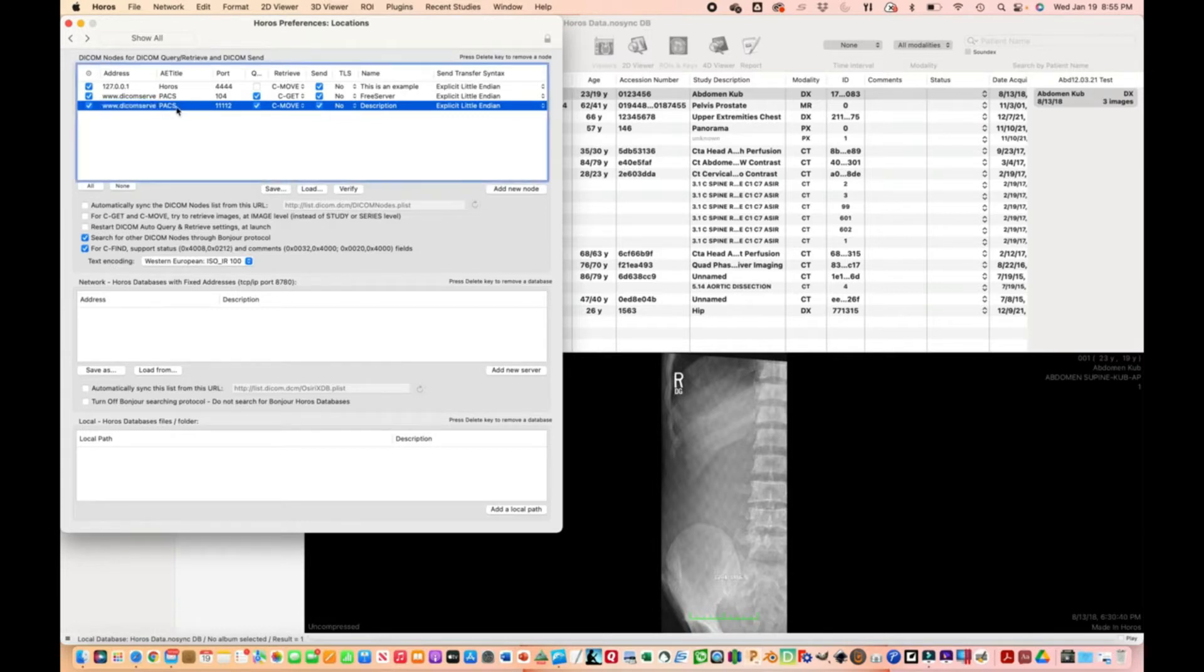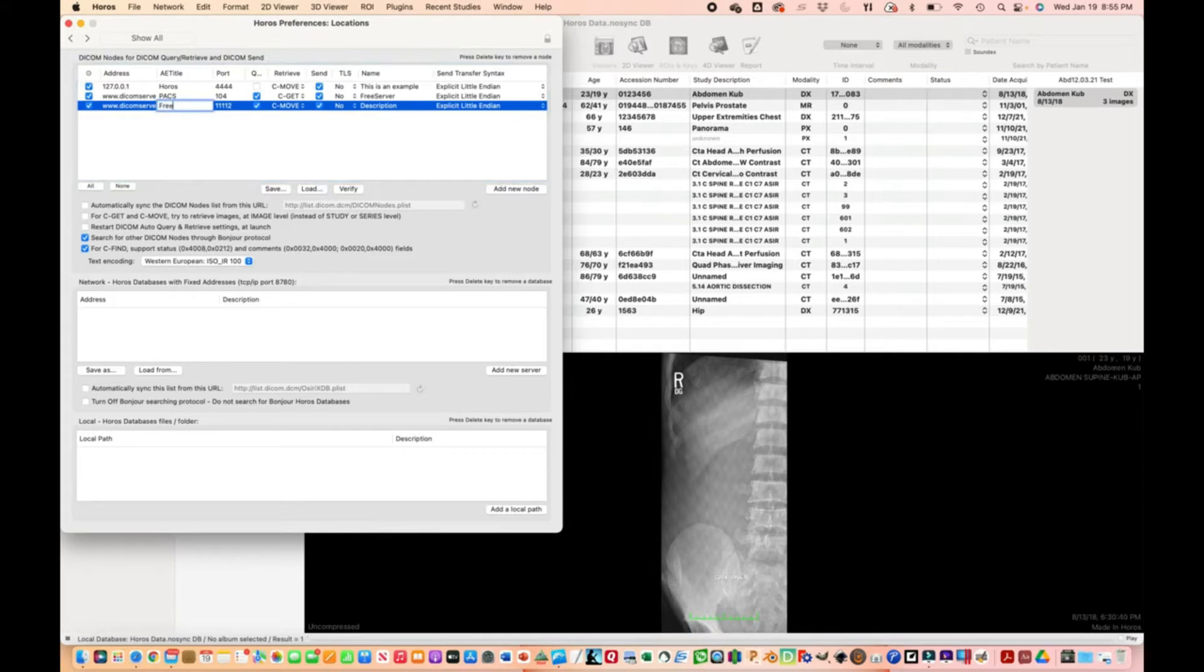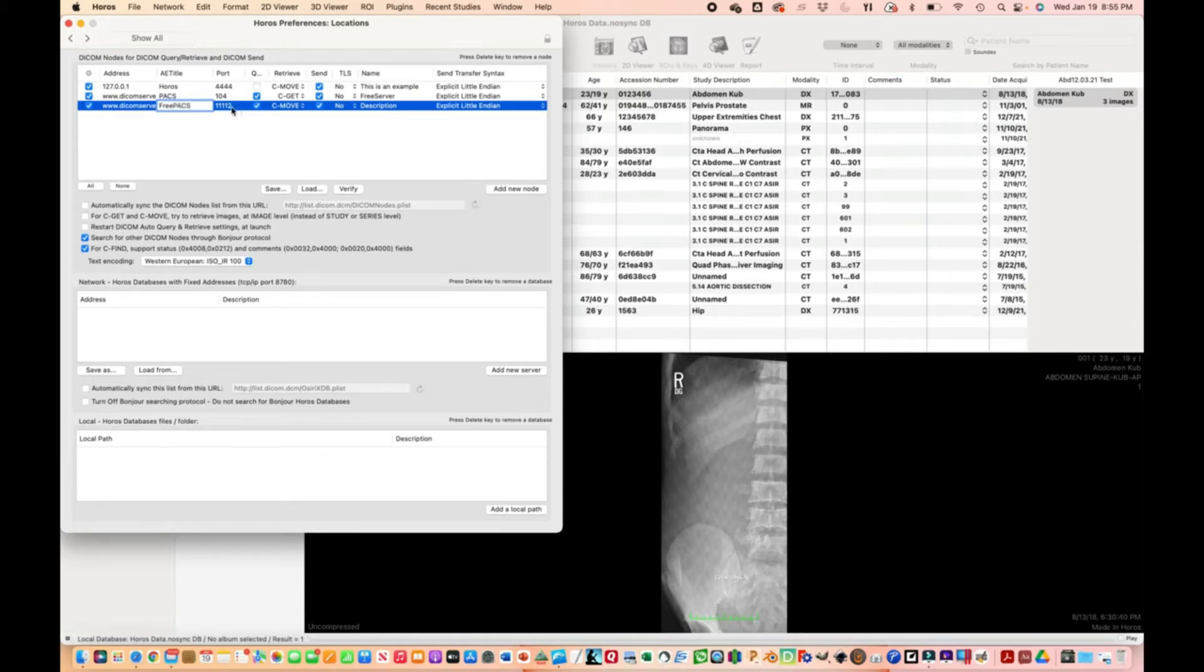For AE title, doesn't matter too much - you can put 'free server' or leave it as 'packs' like the other entry there. Port is 104.